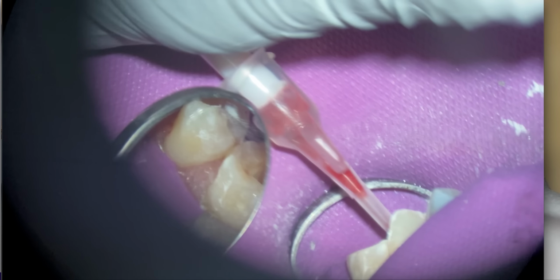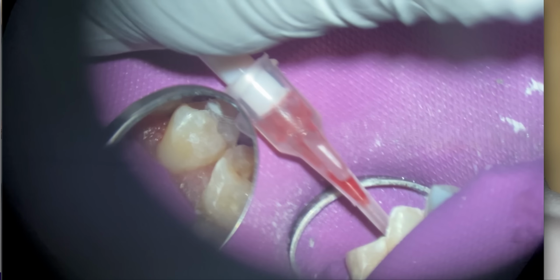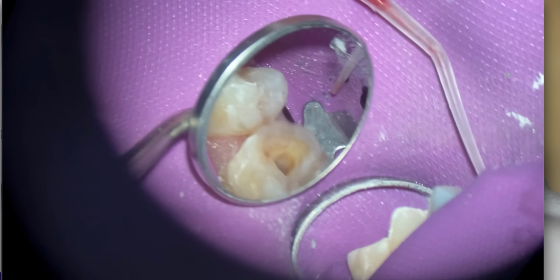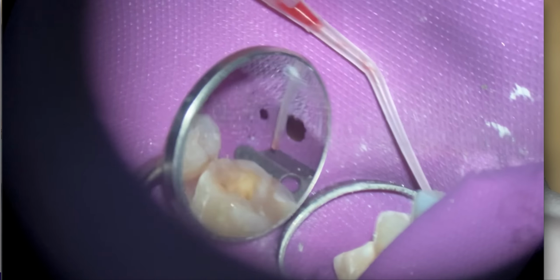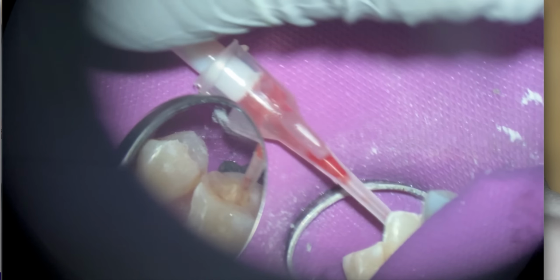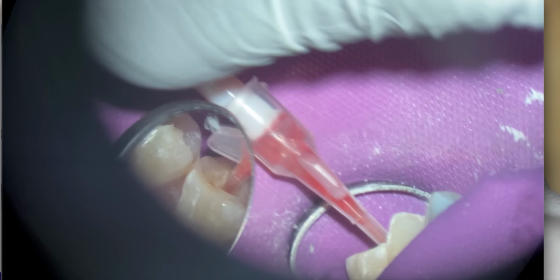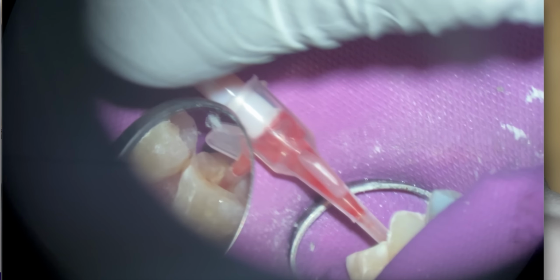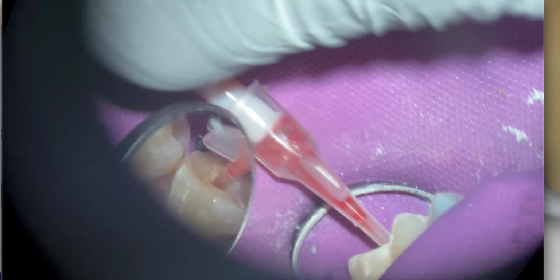Consistently throughout a procedure, I'm asking the patient if they're in pain at all. He wasn't in any pain, and he didn't feel anything. So I was curious. And there's no more drainage. So I'm like, well, maybe. I'm not sure. Well, there's a little bit more. So we're going to make sure that that's completely dry. We didn't have any of that from the buccal canals.